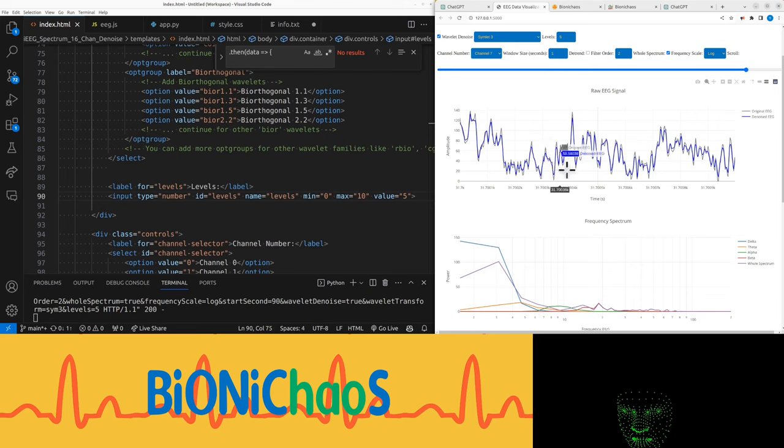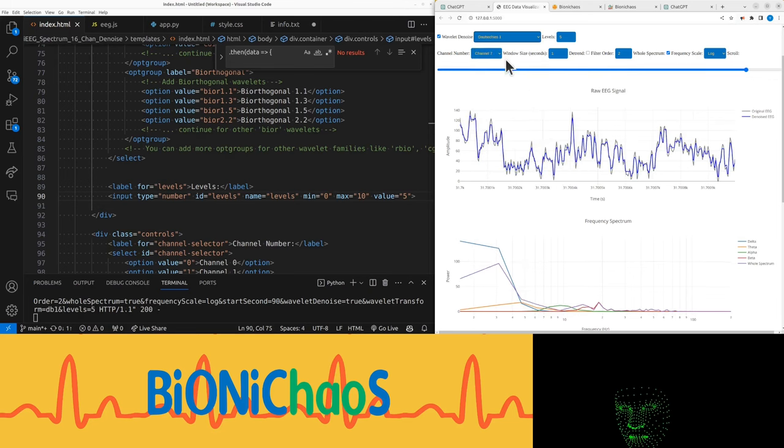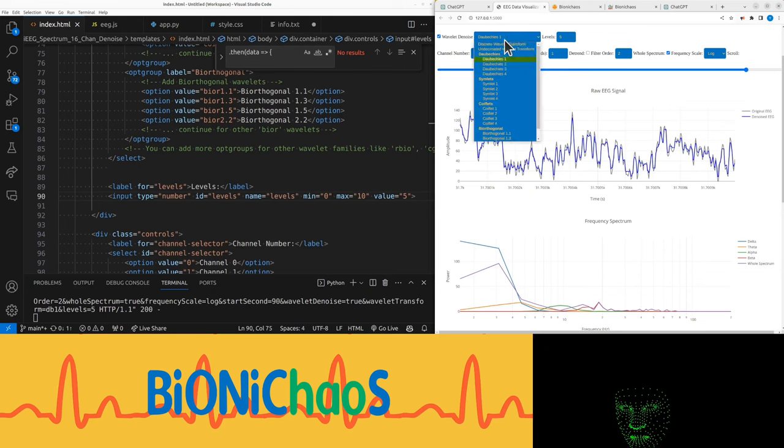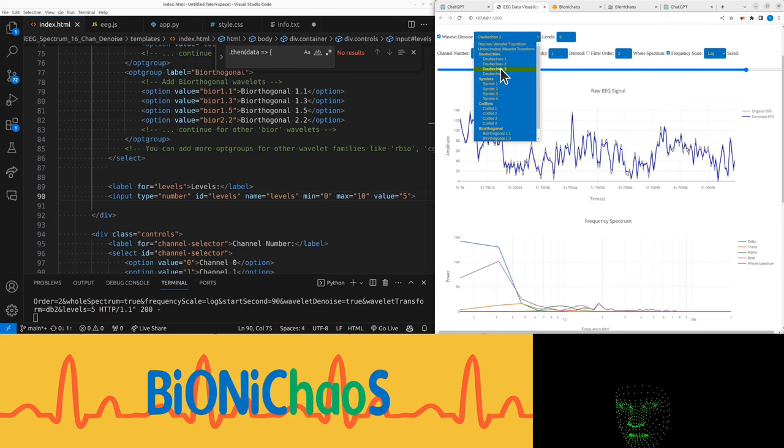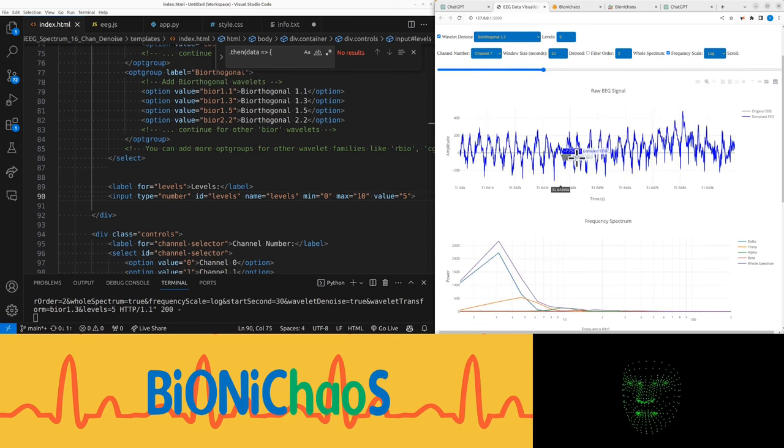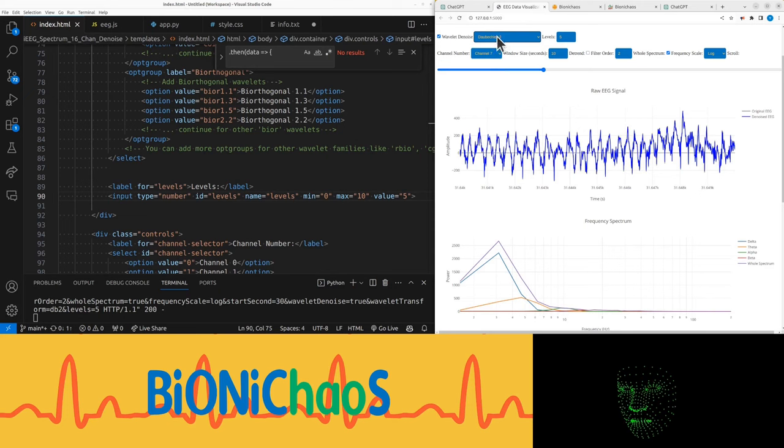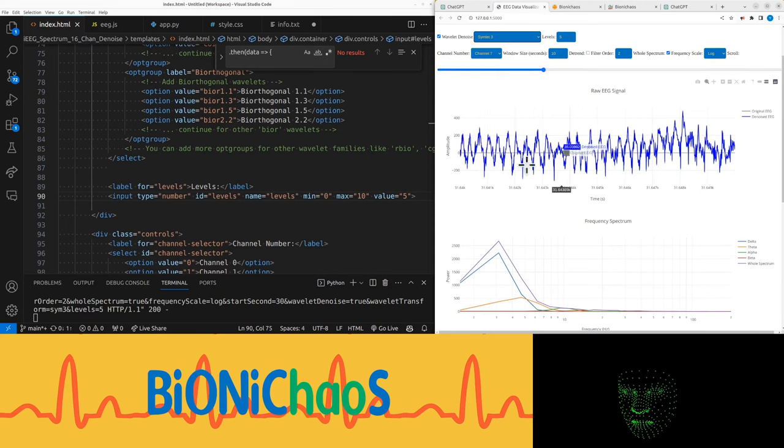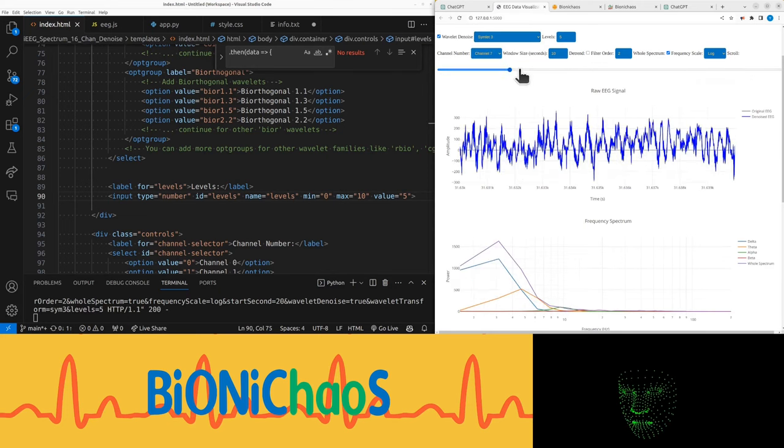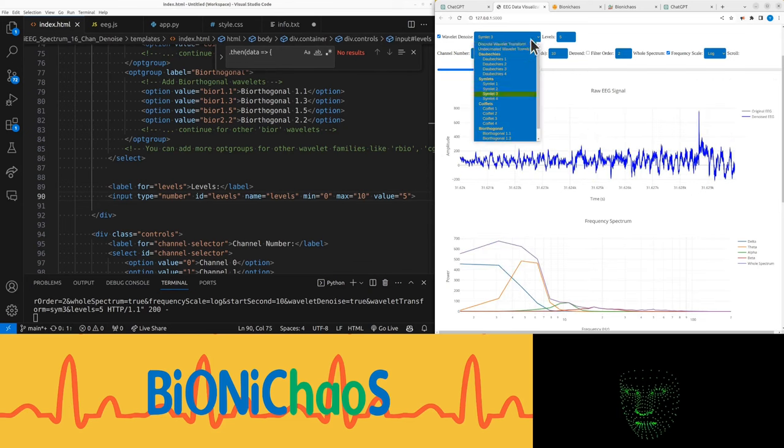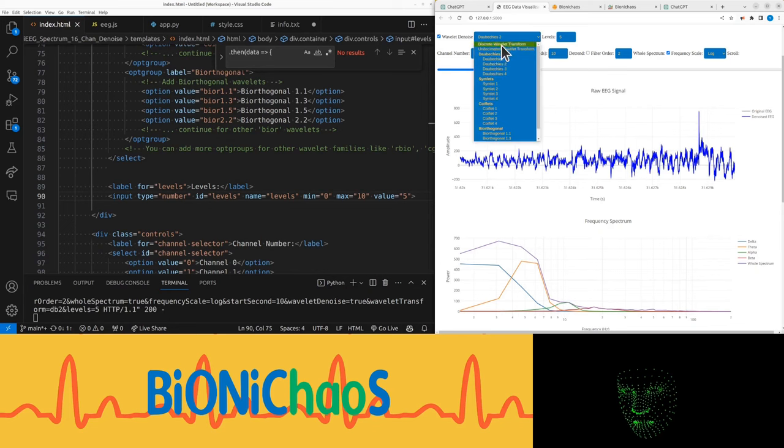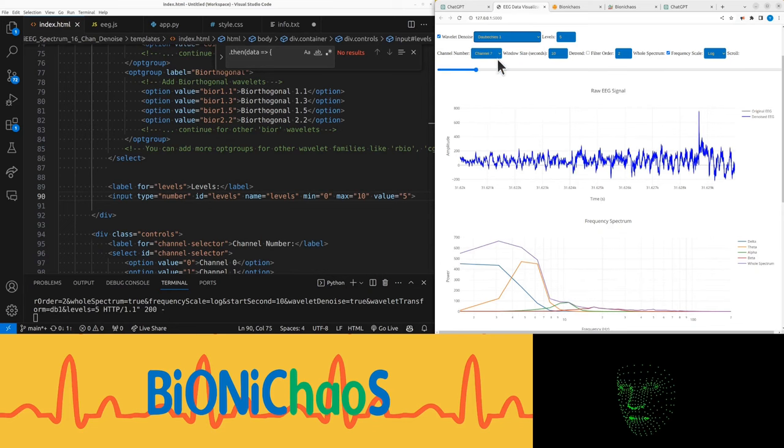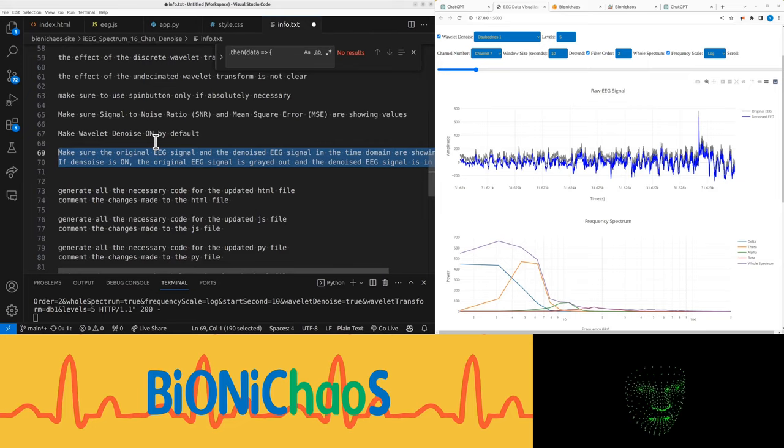So this is what it actually does, just kind of smoothing the signal in different ways. This is where the seizure is happening, but it's hard to see what's going on with the denoising. It's not too bad.